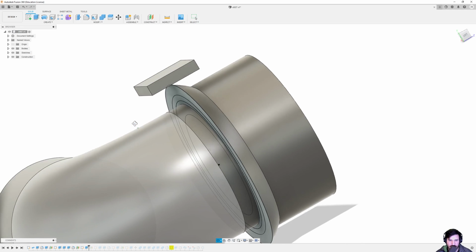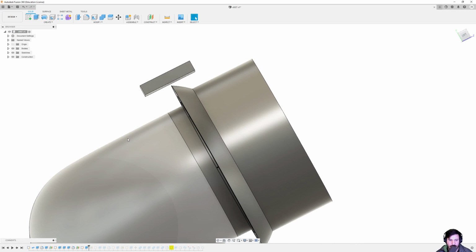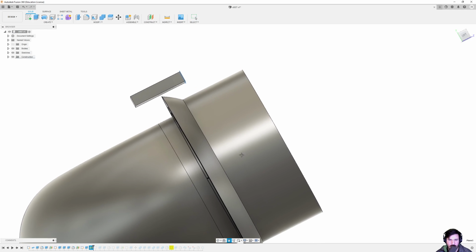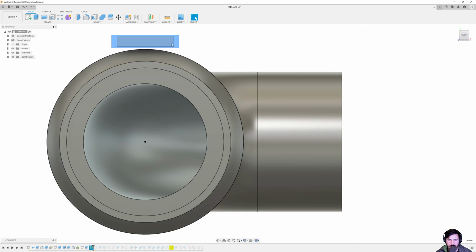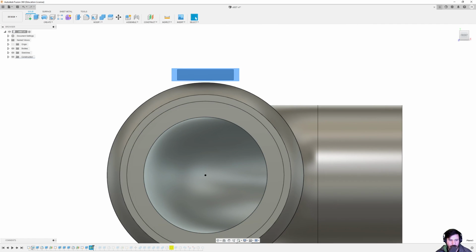So here's the initial shape and position of the clasp. This is a little bit odd because I don't know how to use Fusion 360 very well, so I kind of did it in a way that worked, but maybe wouldn't be the way that you would want to do it. And from there, I made another offset plane on this face right here. This face right here. And then from there, I drew a sketch on there.